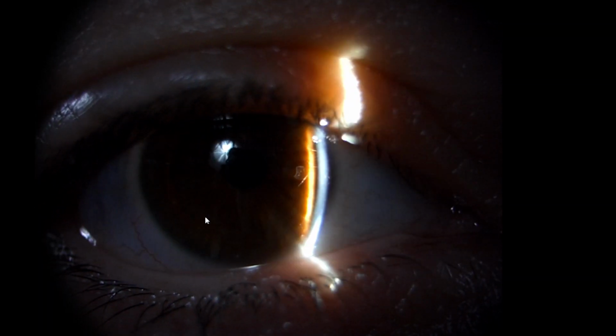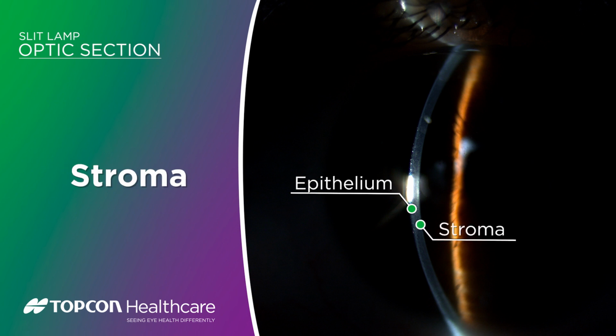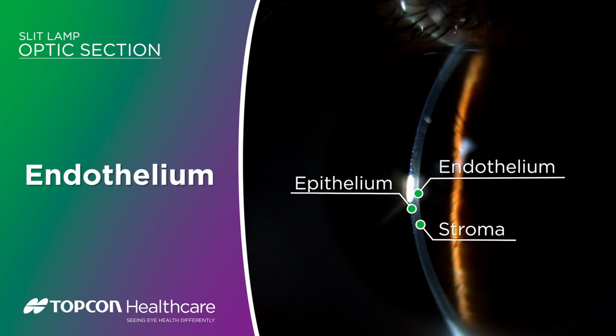With the slit positioned approximately in the center of the cornea, move the slit lamp in and out using the joystick to optimize the focus until you see the thin, bright line of the corneal epithelium with the grainy texture of the stroma behind. When perfectly focused, you can see the main layers of the cornea. With the illumination system on the left, as it is here, the bright layer closest to the illumination system is the epithelium. The majority of the cornea is the stroma, which has the grainy appearance, and the relatively bright layer on the back of the cornea is the endothelium. Note that Bowman's and Descemet's membranes are not visible.